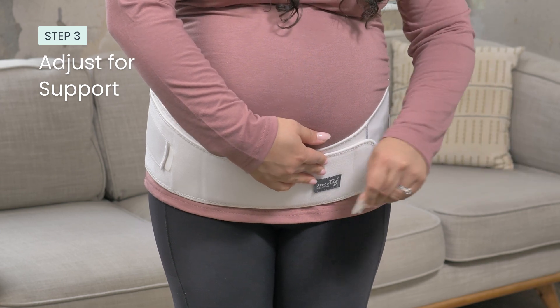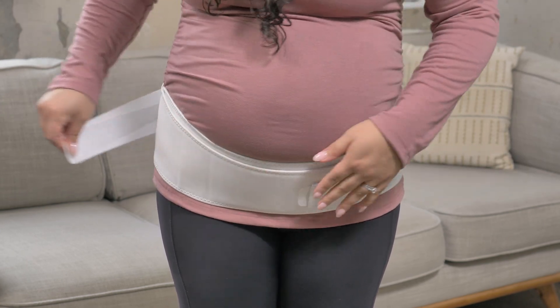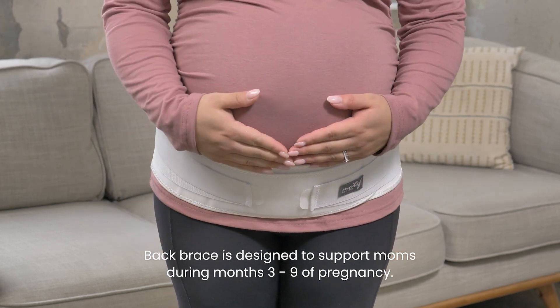Next, adjust the level of support and compression using the side tension straps. You can wear the brace underneath your clothes or comfortably over your clothes, depending on your preference.